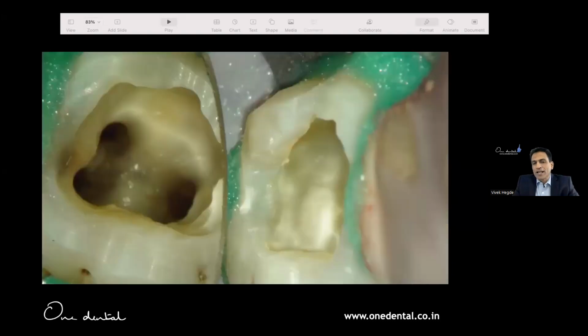And now see the root canal. It's pretty clean. But to get the root canal so clean, it's taken me time. How much time? 20 to 30 minutes post shaping. Coronal 1/3 looks all round and circular and nice. That's all I can see. Can I see the middle third? Maybe under the microscope. Can I see the apical third? No, because it's curved canals. I have to rely on my tactile sense, my other experience as we go through.